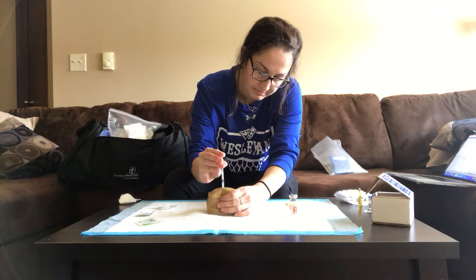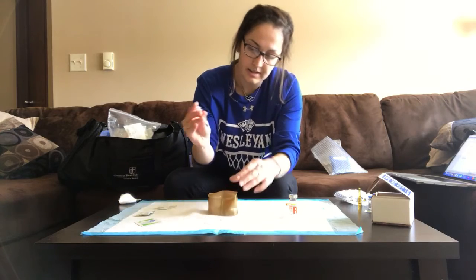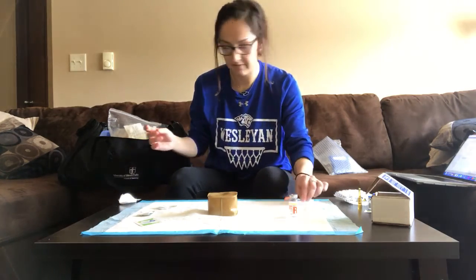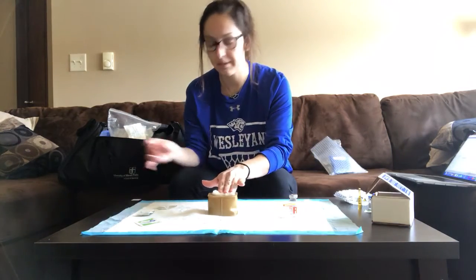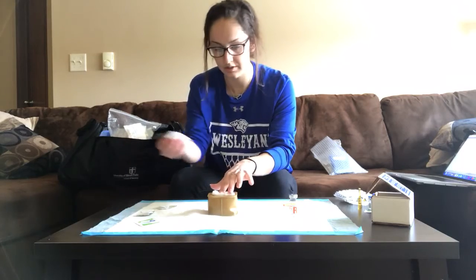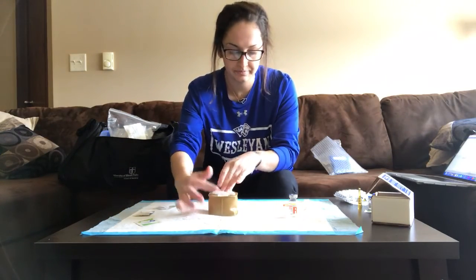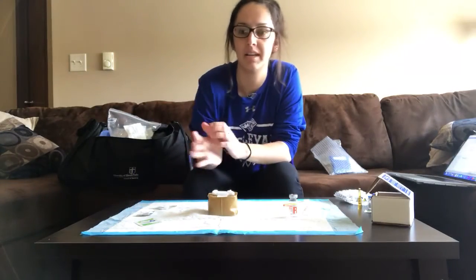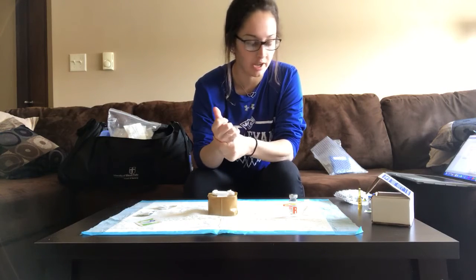Insert the medicine, and then as I release the needle, I'm going to release my hands, and then I'm going to do the one-handed scoop on the needle, cover that, get a gauze, and lightly apply pressure. You don't want to massage it or anything. I'm just going to tape it. Okay. And then, oh, I don't know if I said this in the beginning, but I would be wearing gloves throughout the whole procedure after I did my hand hygiene.